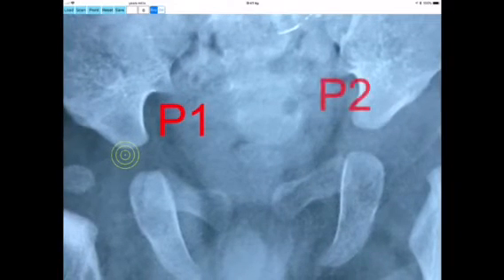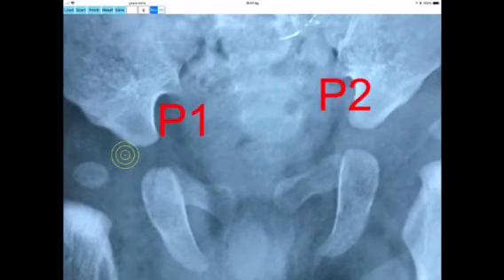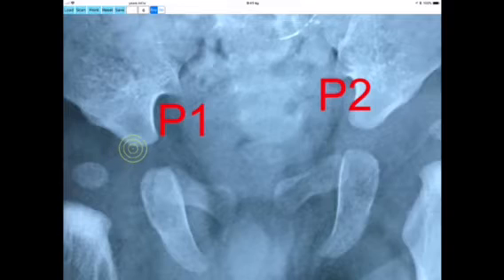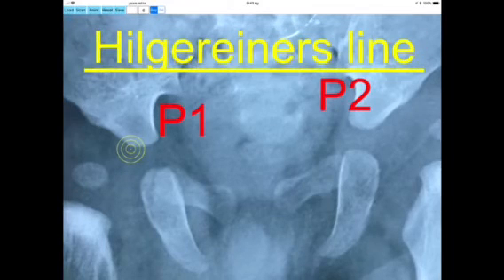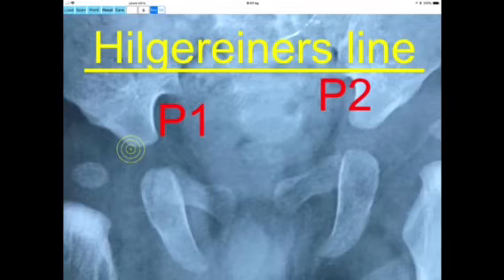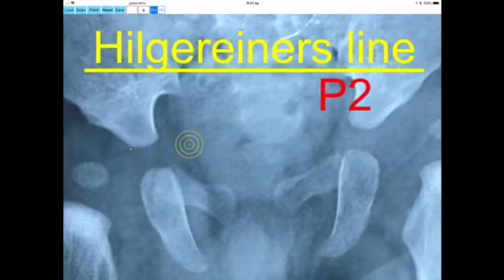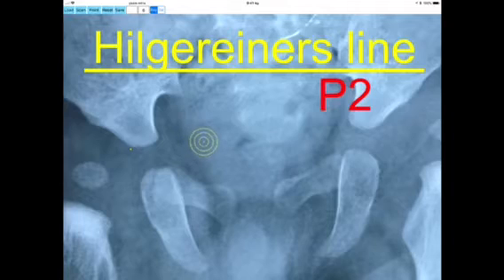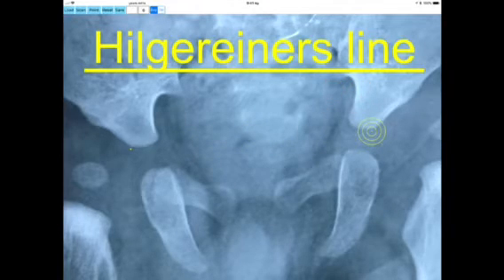By moving the circular template over the juncture of the triradiate cartilage of the left hip and clicking the point button, the second point P2 is marked. The selected two points are joined by a horizontal line, P1-P2, the Hilgenreiner's line through the right and left triradiate cartilage of the acetabulum.